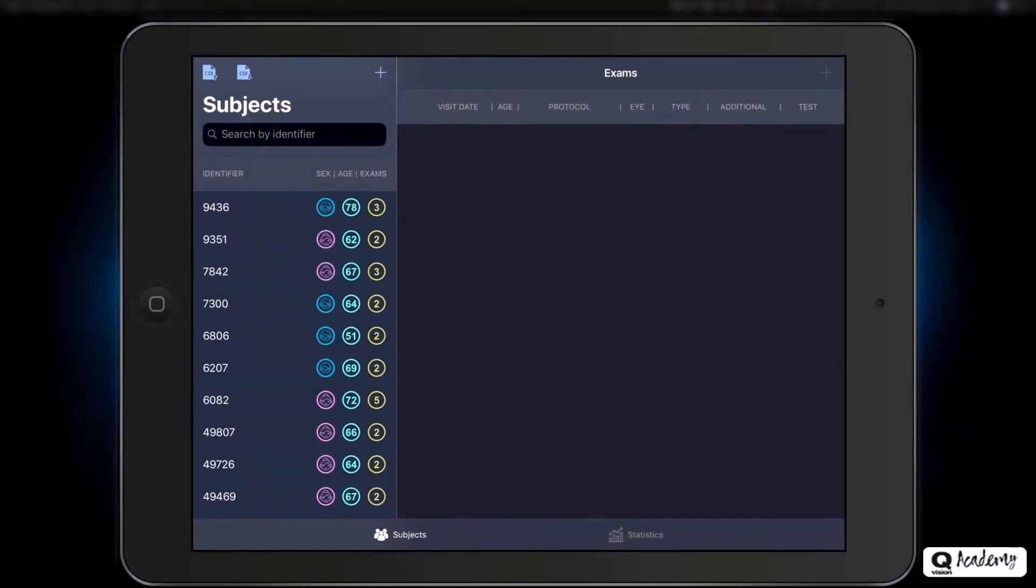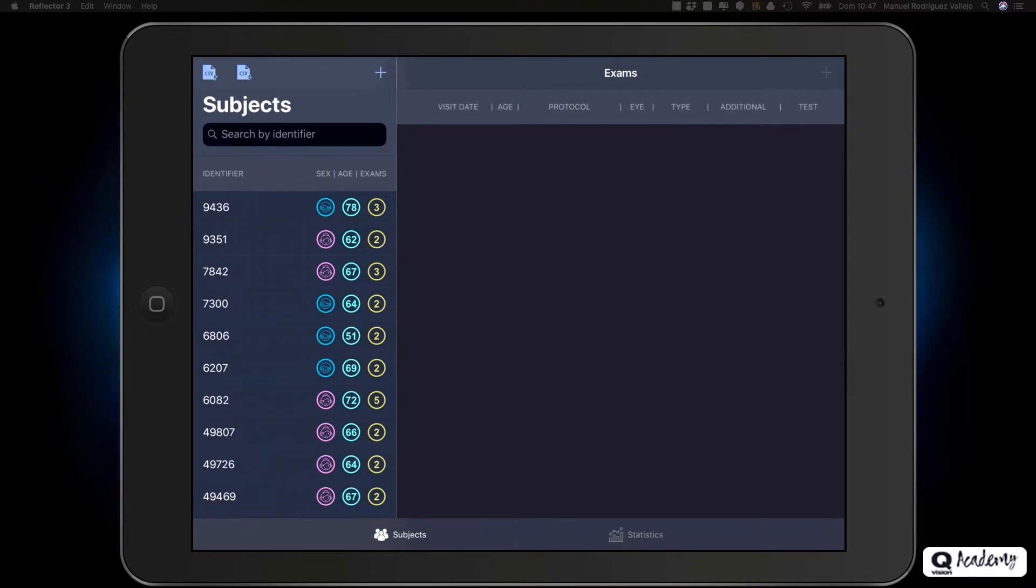Welcome to the Pro version of the Multifocal Lens Analyzer. In this tutorial, we will show you how to use the app for the first time.